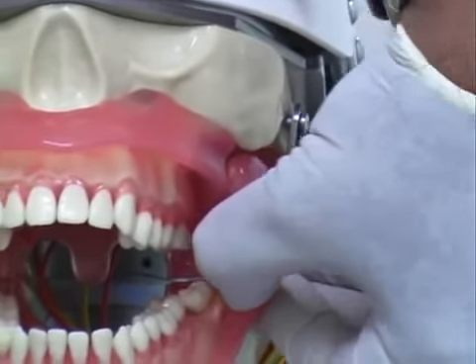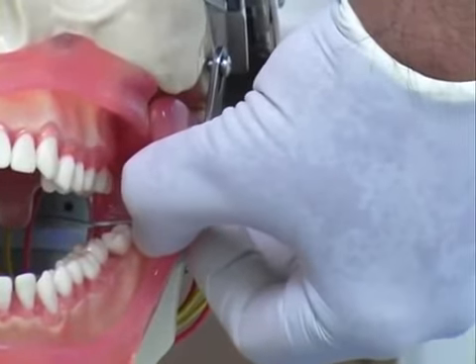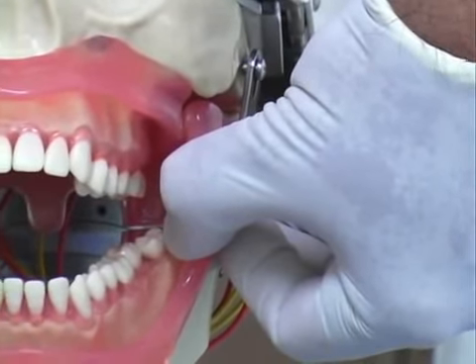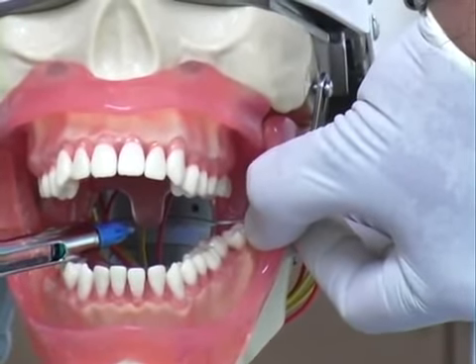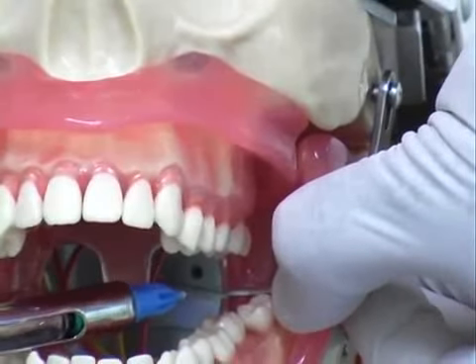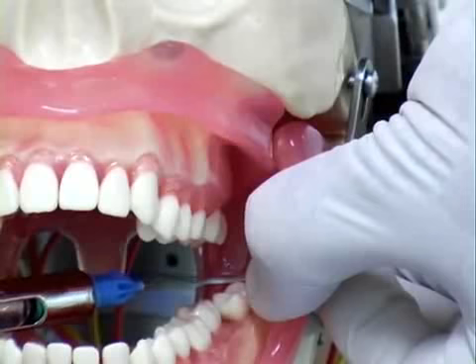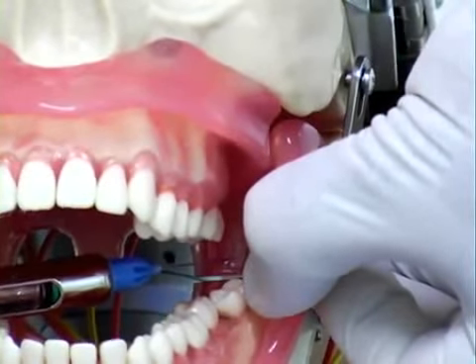Here you can identify the coronoid notch where the thumbnail should be put, while the barrel of this syringe is lying on the opposite side of the premolar. You can have an injection point here, 5 millimeter medial to the coronoid notch and about 1 centimeter above the occlusal plane, which is here.